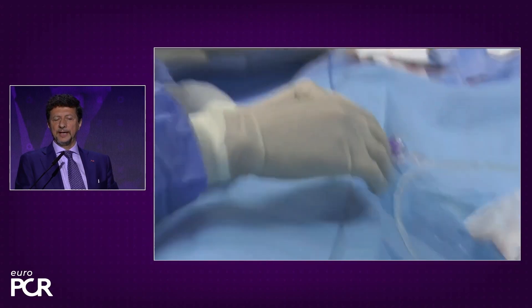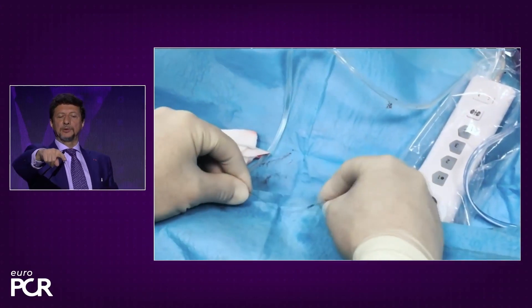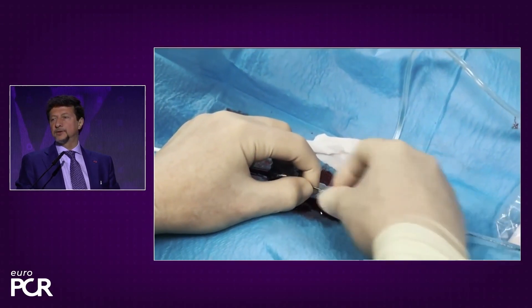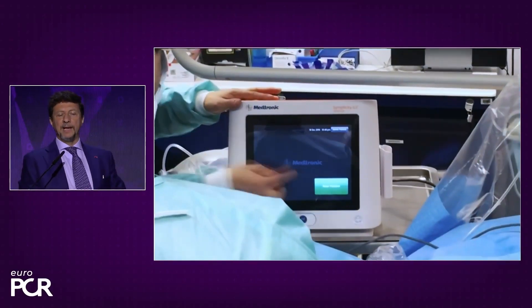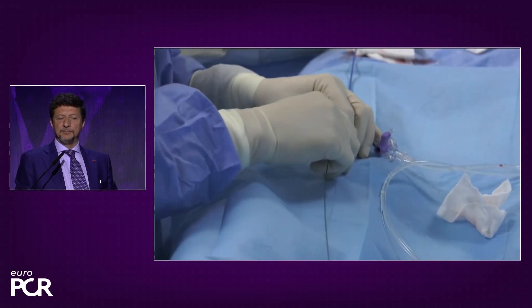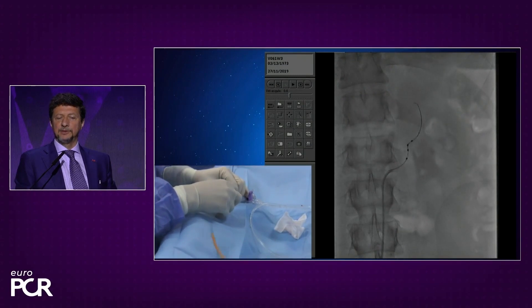You can see the four electrodes entering the guiding catheter, and the remote control with the four buttons to control the energy — in all four at a time, or you can select one, two, or three of them according to your planning. On the basis of the angiography, you will plan where to deliver the energy. From the external part, a non-sterile assistant will turn the system on. As you can see, it's a rapid exchange system like a coronary balloon, and you see how easily it advances even in tortuous anatomy.